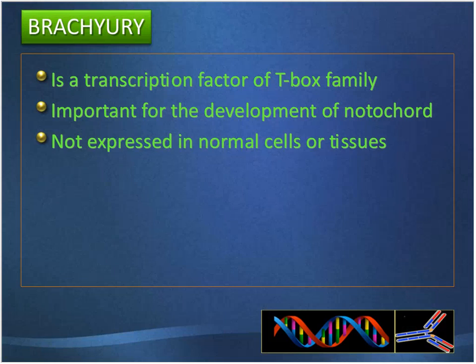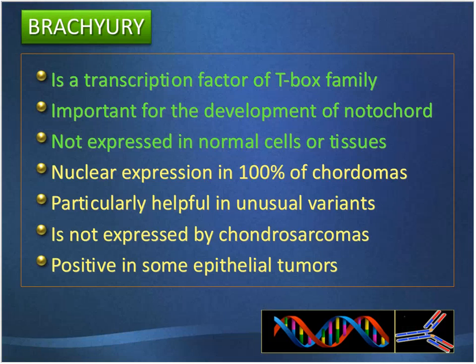That's why this particular marker is a great marker for most chordomas. Almost all of them stain for brachyury. And it's also particularly helpful in unusual variants. As you know, chondrosarcomas are sometimes in the differential diagnosis of chordomas, but chordomas are positive for epithelial markers, chondrosarcomas are not.